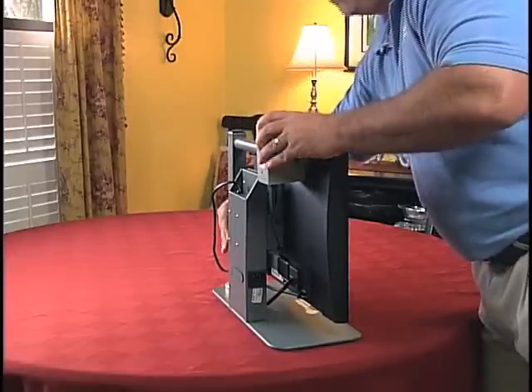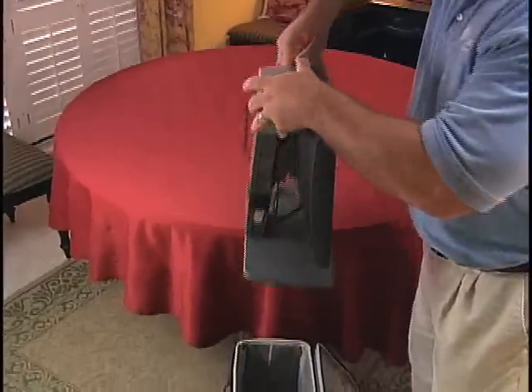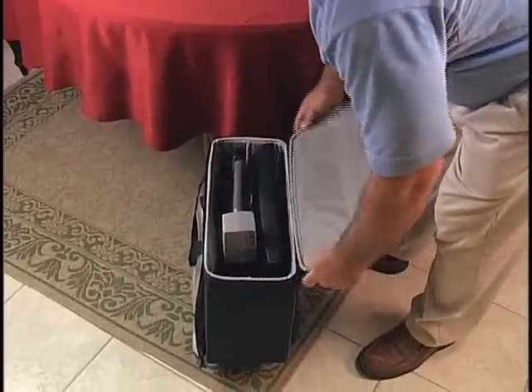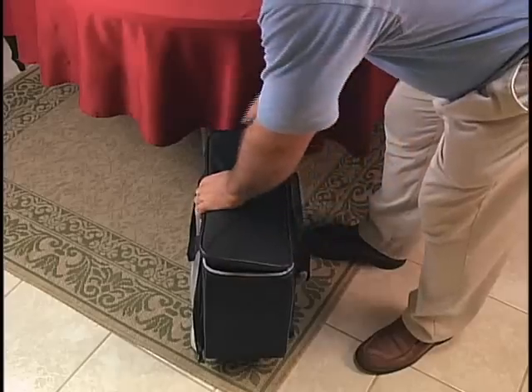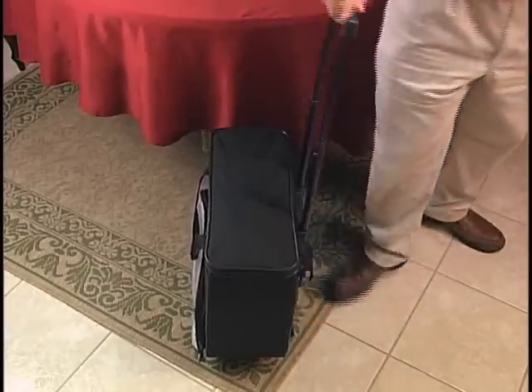When I am ready to move on, I just lower the arm and I have a compact unit that stows in its own rolling case with a telescoping handle. And I'm off to class.